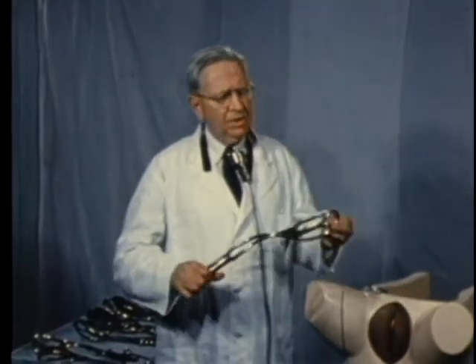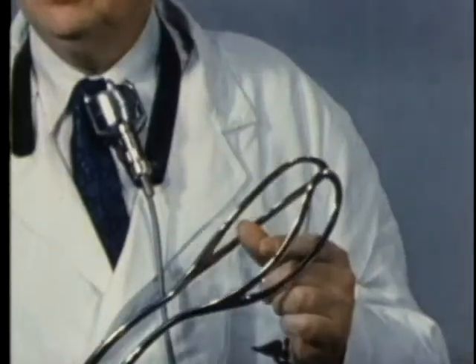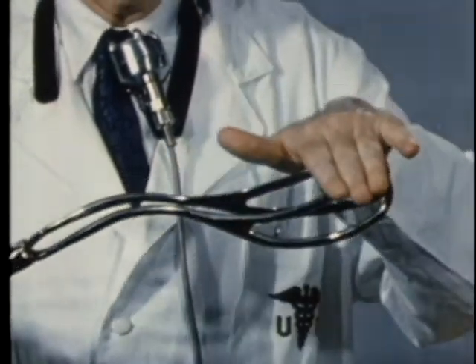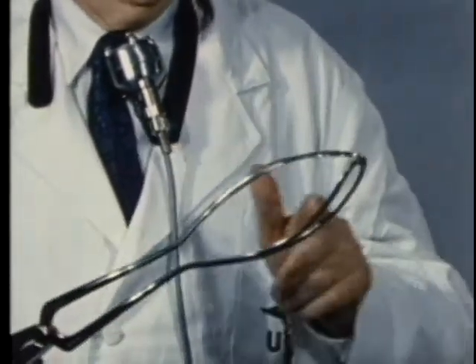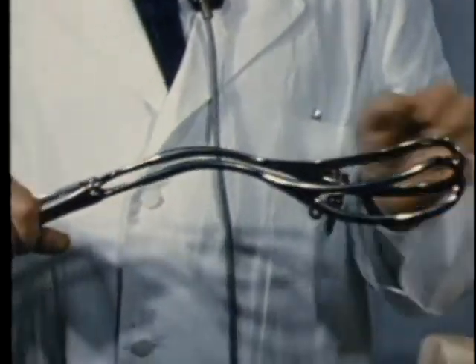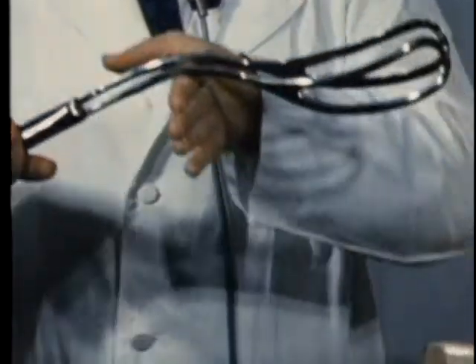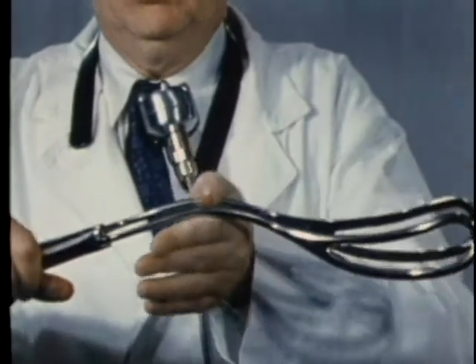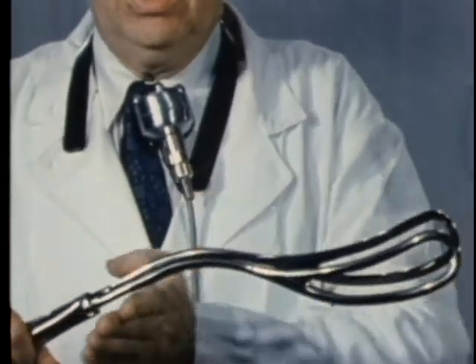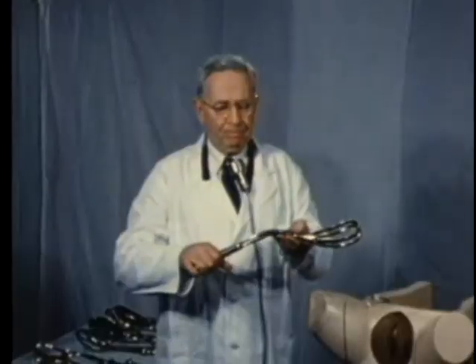In the construction, the blades are a modification of the Tarnier type with a slight pelvic curve and a narrow cephalic curve. The shanks are extra long and separated and bent backward in the middle, lowering the handles and the adjacent portion of the shanks to a lower level than that of the classical instrument.